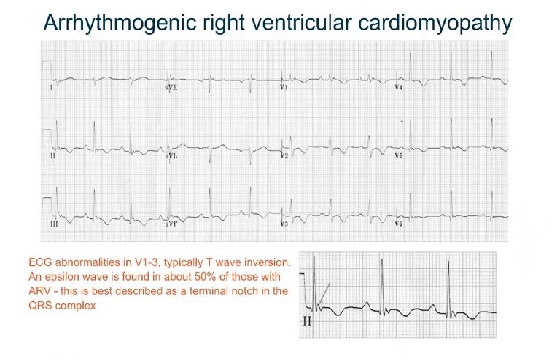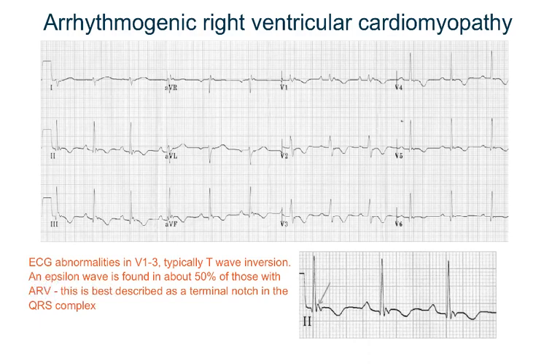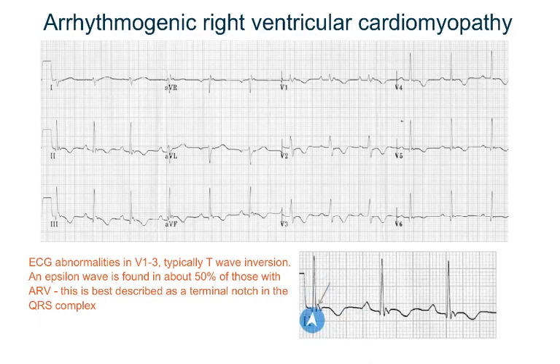This is an ECG of arrhythmogenic right ventricular cardiomyopathy. The criteria is that in leads V1, V2, and V3, you will see T wave inversions in all three leads — really evident in this ECG. The second finding is that in 50% of patients you will find an epsilon wave, which is a notch at the end of the QRS complex. Here is a zoomed-in picture showing the QRS and then a small notch before the T wave inversion.